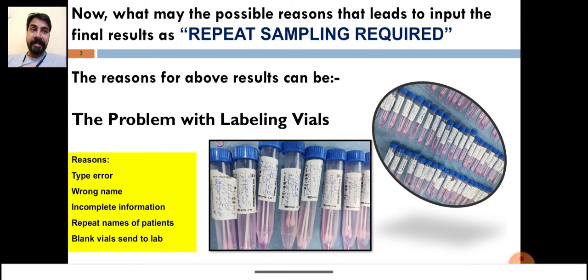This problem is with the collection facility. The technician will collect your sample and there they will do a typo error. See these are the vials—can you differentiate the names on these vials? I don't think so. How can we report these samples as positive and negative, and how can I identify whose sample is this?